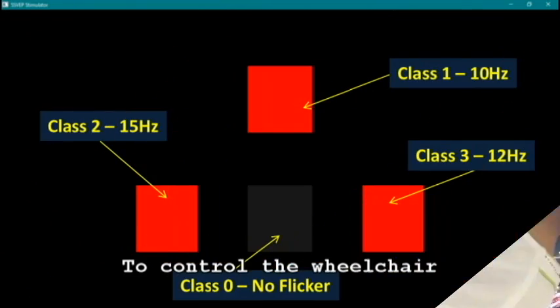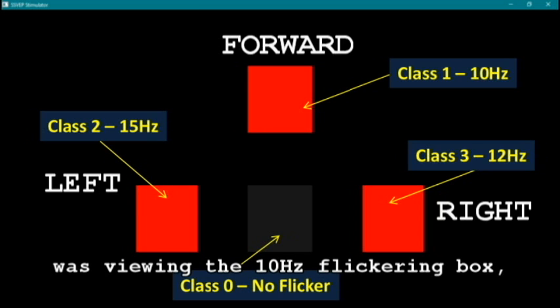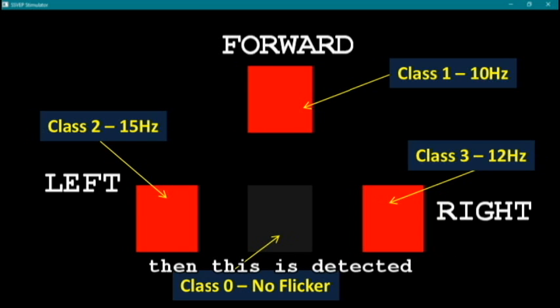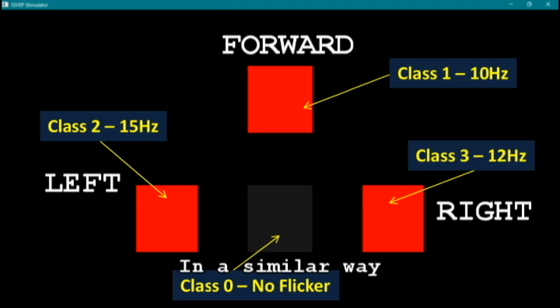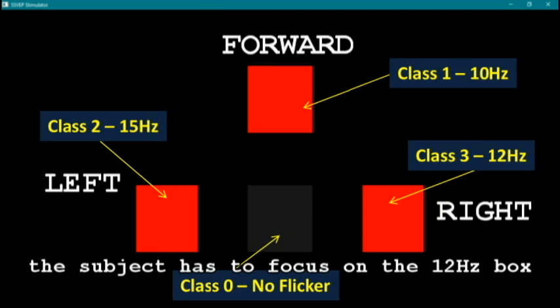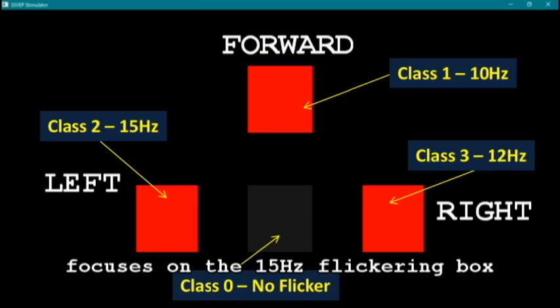To control the wheelchair, the subject has to view any one of these boxes. If the subject was viewing the 10 Hz flickering box, then this is detected from the EEG signal and it is mapped to a forward command to move the wheelchair. In a similar way, to move the wheelchair right, the subject has to focus on the 12 Hz and to move it left, the subject focuses on the 15 Hz flickering box.